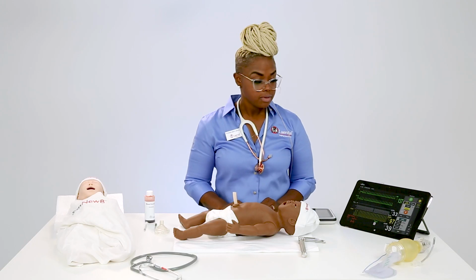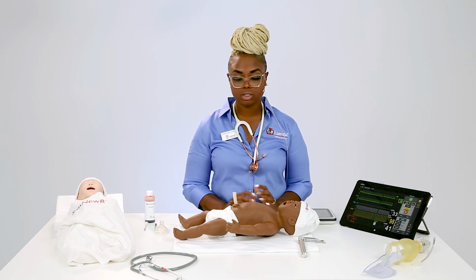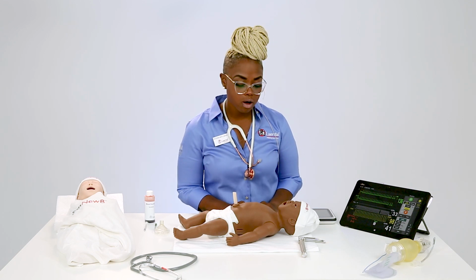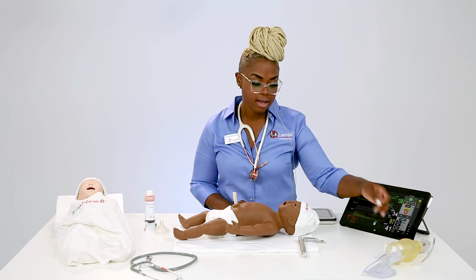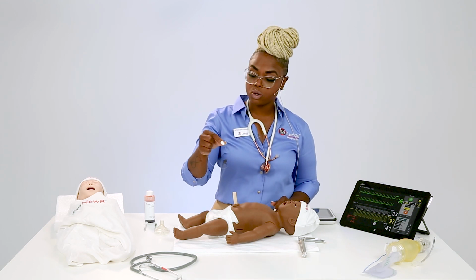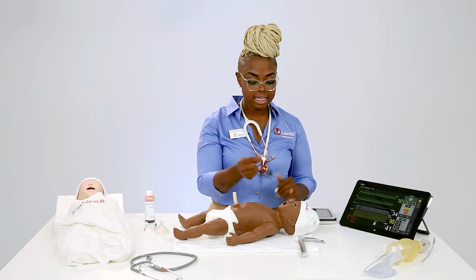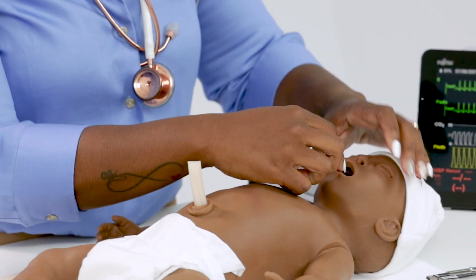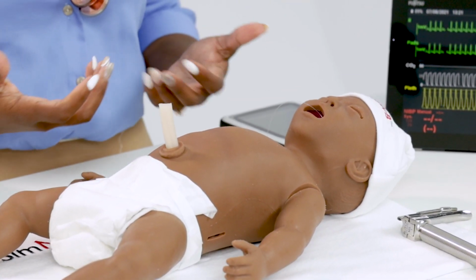Thanks. And then why don't we show them a little bit about how meconium can be integrated? Absolutely. One of those issues with newborns is a concern of meconium aspiration, which is a clinical emergency. Although SimNewB is not able to have fluids placed in the airway, you can simulate suctioning, which is important in a newborn. You have this, and this is going to be your simulated meconium. How you would insert this is you're going to take this and put it down. There you go. So now you have your foreign body or your airway obstruction.